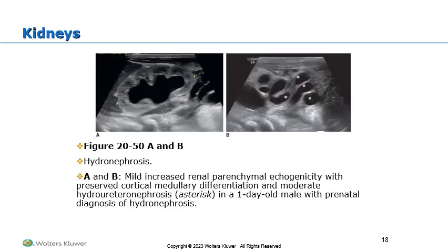So here's a couple examples. In this particular case, we don't see any of the ureter, unless this happens to be the ureter, I can't tell for sure. But what we do know is that this is definitely greater than 1 centimeter across our renal pelvis. This is where we're already getting compression into the minor calyces, and really compressing all the way into the pelvises here, and here.